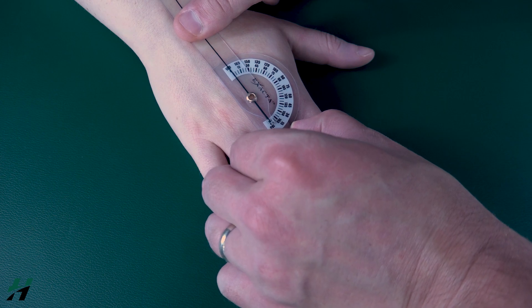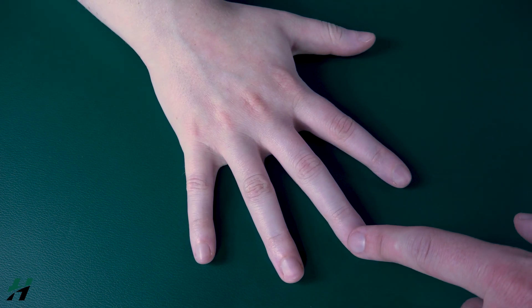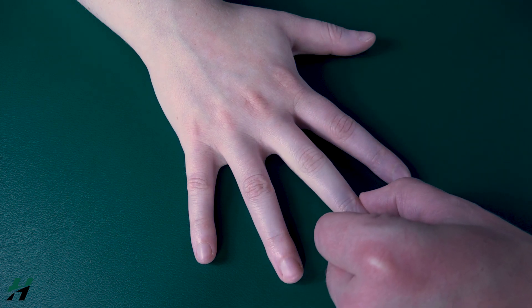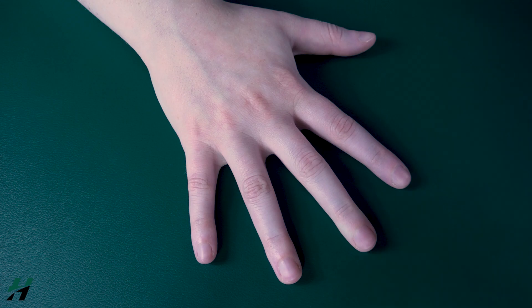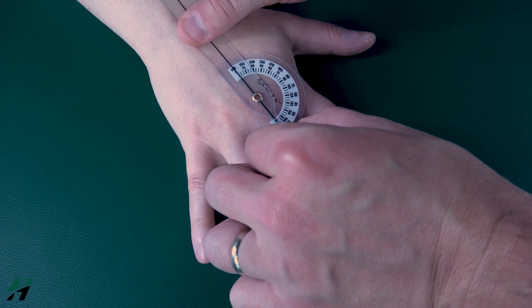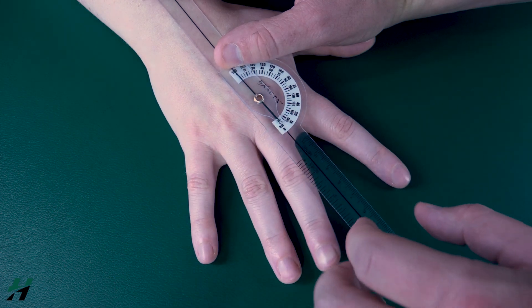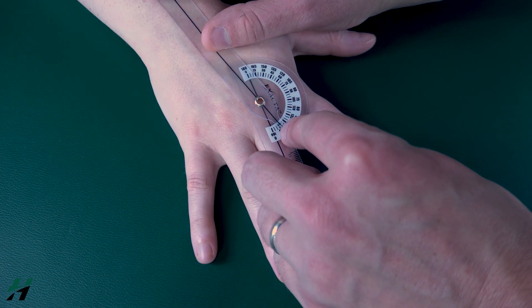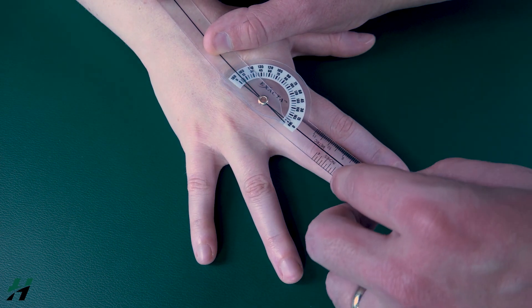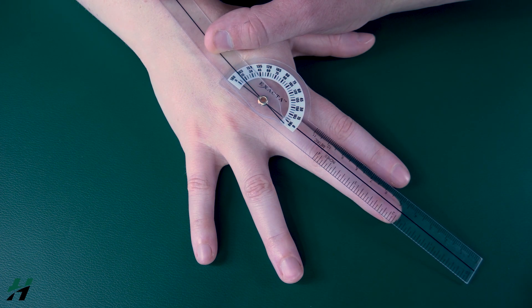Always measure with the proximal phalanx. Rachel, spread your fingers outward. You'll notice the middle finger did not move — these outer fingers did. For the third digit, we measure both radially and ulnarly: axis on the third MCP, stationary arm on the third metacarpal, movement arm on the proximal phalanx. Moving just the middle finger to the ulnar side — that's about 15 to 16 degrees of abduction. Moving to the radial side — about 12 to 13 degrees of radial abduction.